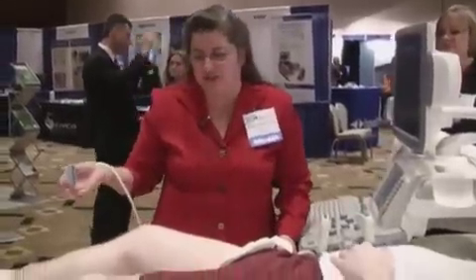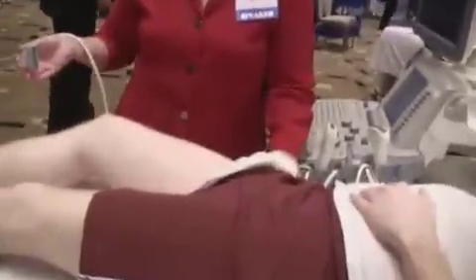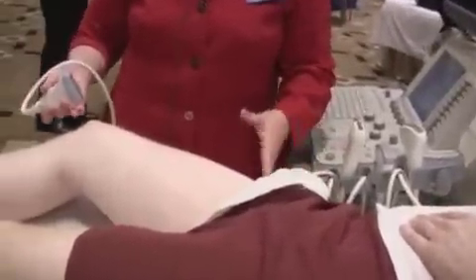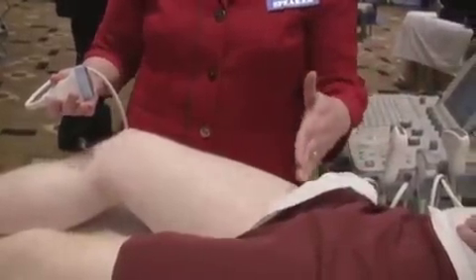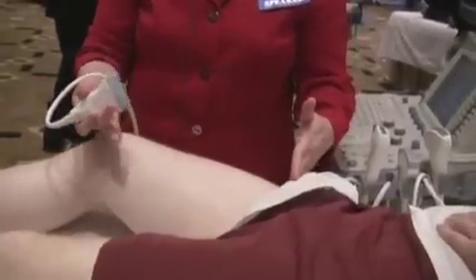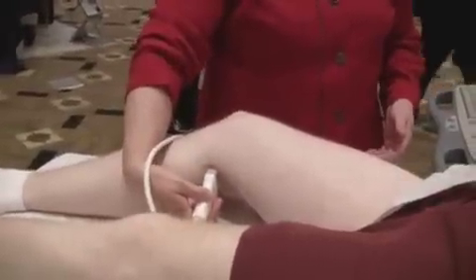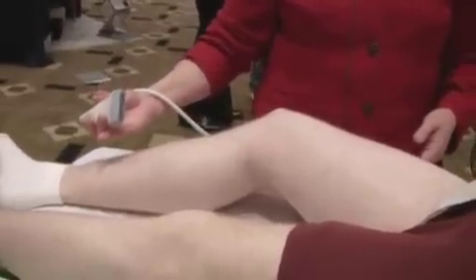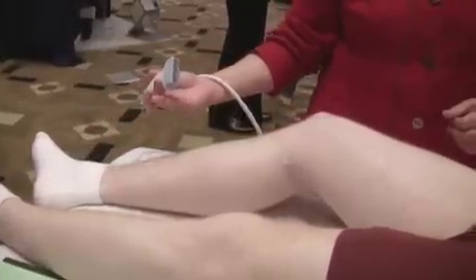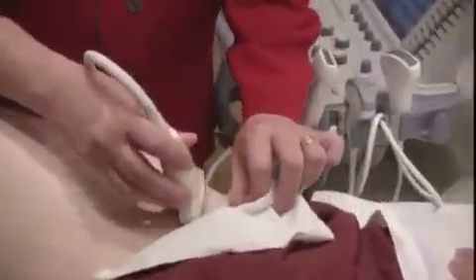As you can see from the patient, this is how we would like to have folks position, having their hip slightly externally rotated and their knee slightly flexed. From this orientation, we can pretty much see from the common femoral artery up here, down through most of the superficial femoral. Then we'll come behind, more posterior approach here to look at the popliteal, and then continue on down the calf, and we can pretty much see everything from this view. We'll just have to turn the leg when we go and evaluate the anterior tib. But we'll start up here at the groin and orient.